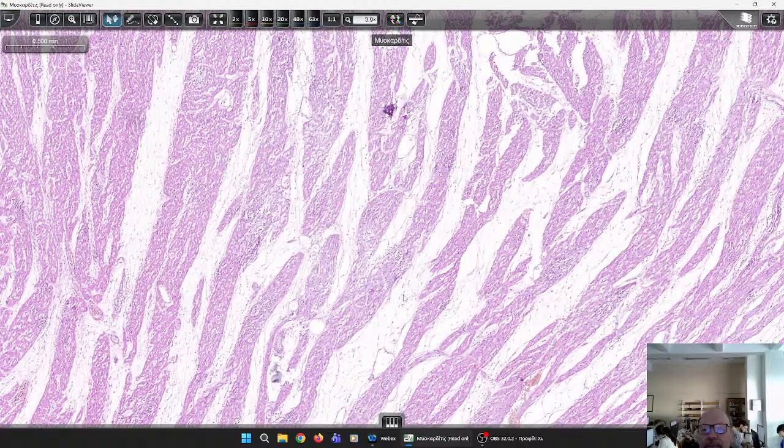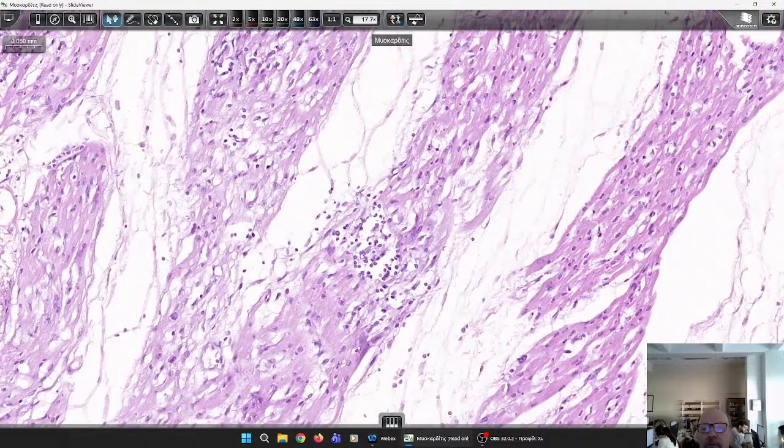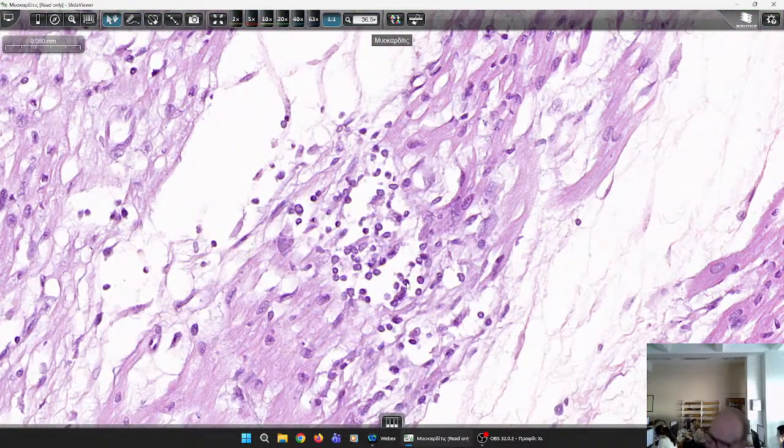However, we can see the edema, the inflammatory edema, and furthermore, here is an aggregate of inflammatory cells, the morphology of which is consistent with the viral etiopathogenesis of the infection, because when we have viruses as infectious agent, the inflammatory exudate consists of which cells?